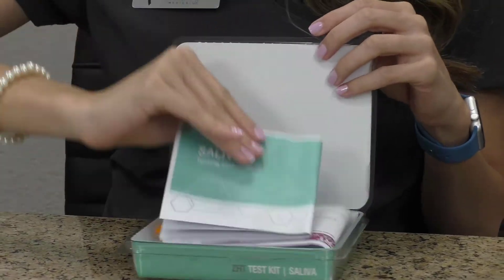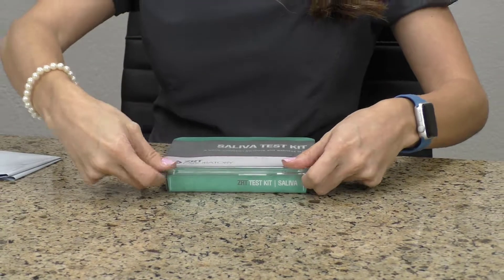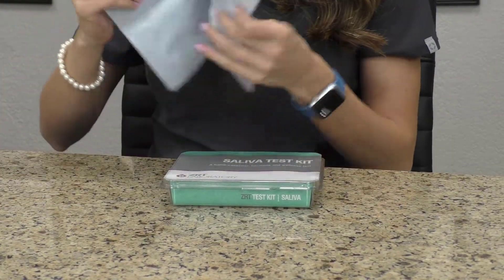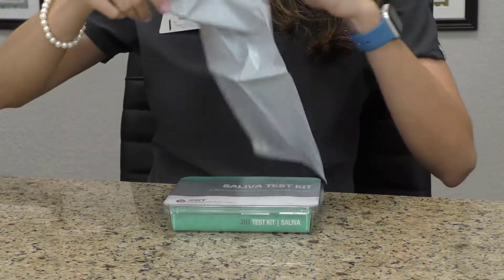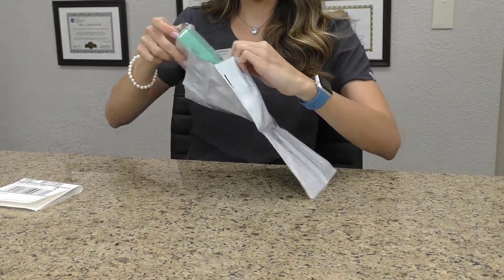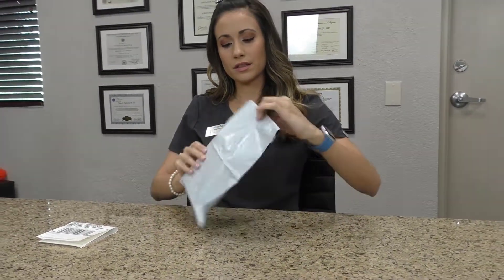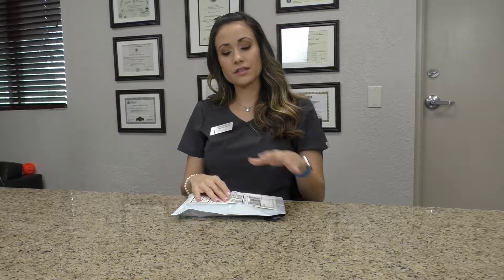We're going to put the information in there, then close our little kit up, grab our shipment bag, put the whole kit inside the bag, and close it up. Then right on the front, we grab our shipping label and place it there. Once we've done this, just go to your local UPS and drop it off.